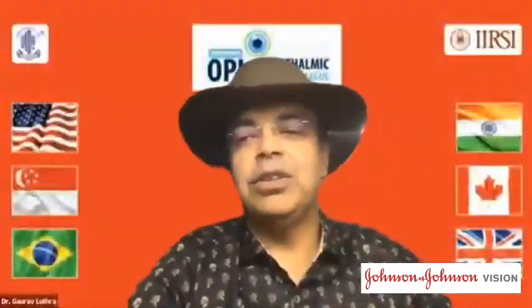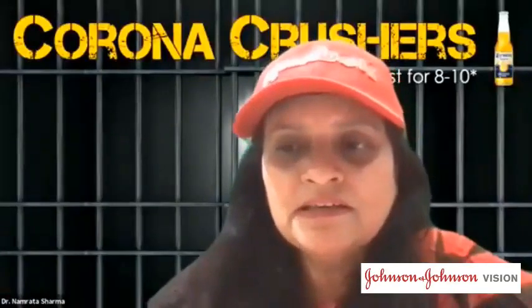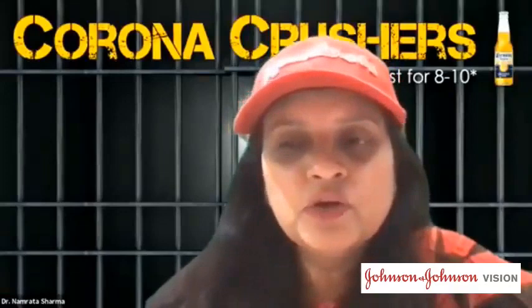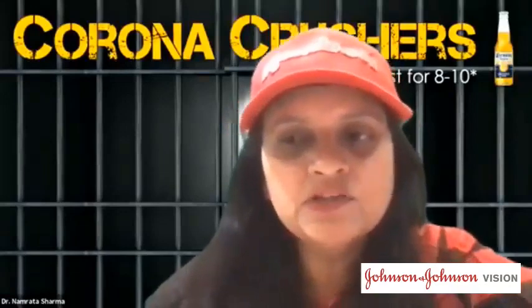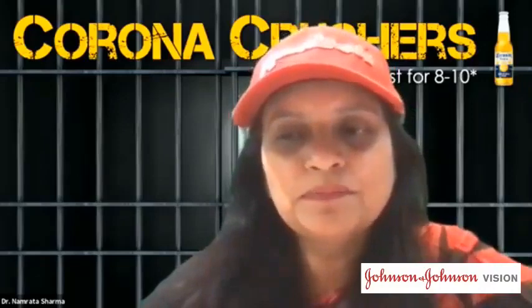And if you have any questions on Susan's presentation. There is a question for Professor Jagat Ram, sir. Did you put a lens there? Was that lens customized? Where was it obtained from?